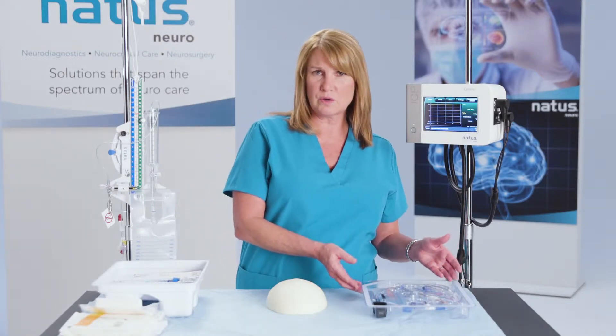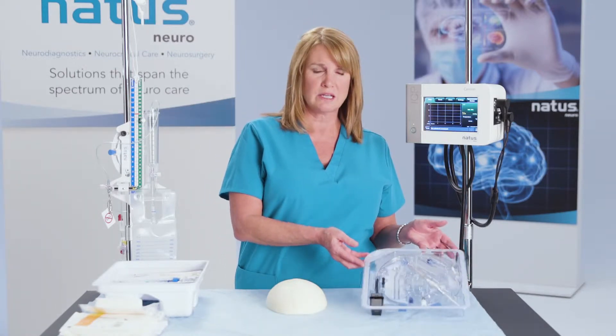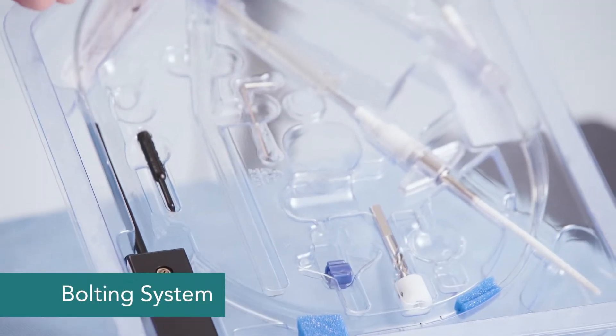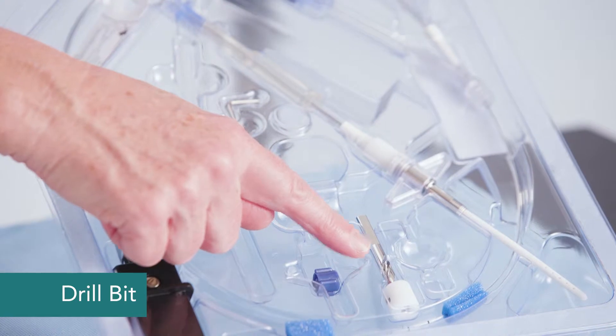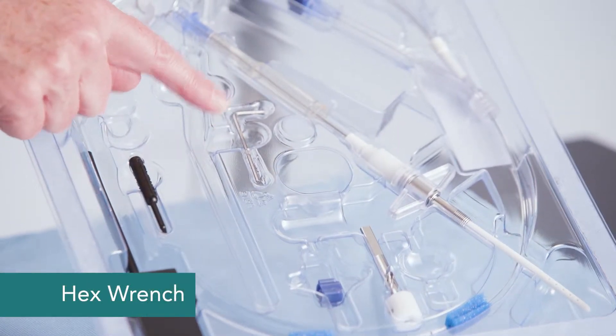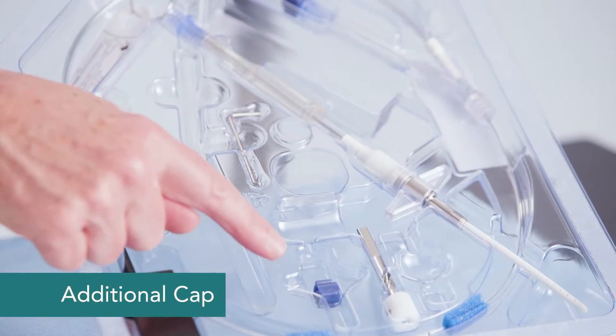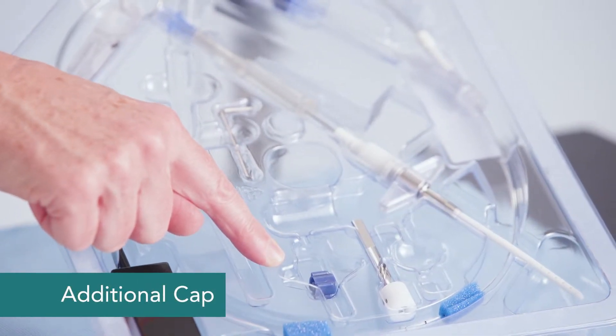Inside of the 110-4-HM kit, what you'll find is the fiber optic catheter, the bolt, the drill bit, the hex wrench, the zeroing tool, and an additional cap for stopping the flow of CSF.